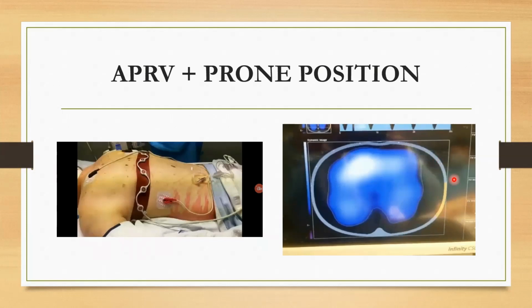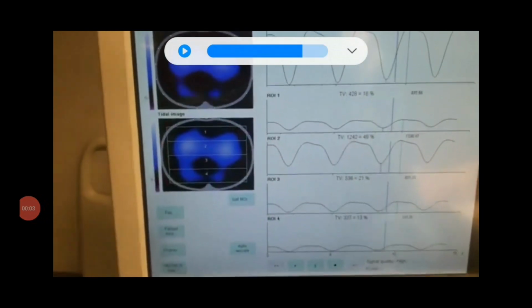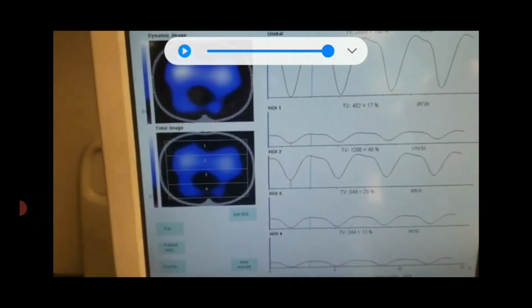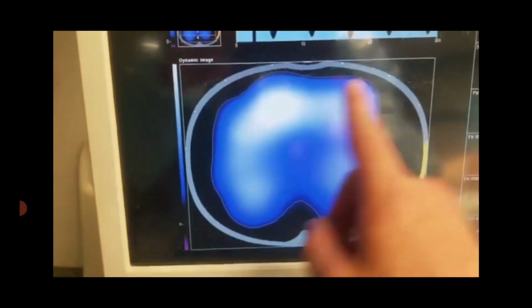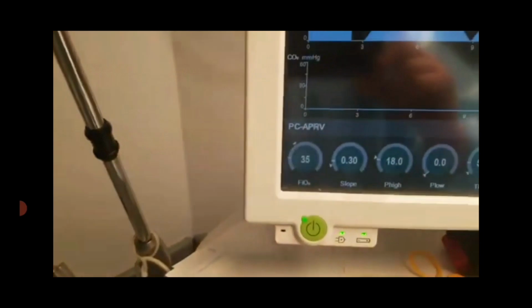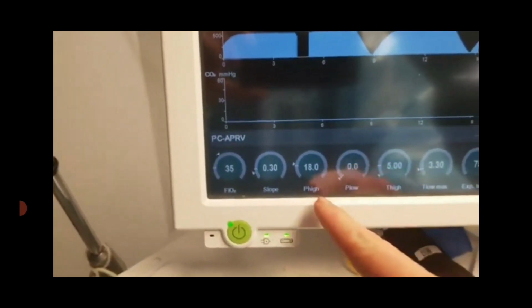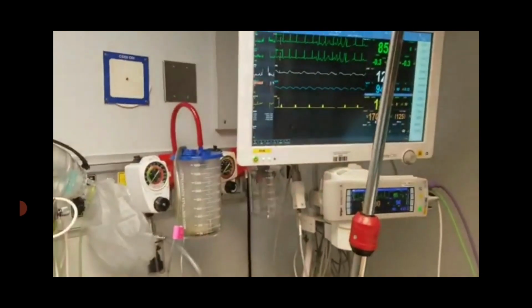So I sent a 24-second video to the doctor. I'm quite happy and giddy because of the amazing result, and you'll probably hear that in the tone of this video. When we were in the recovery room having trouble with the dorsal region, and watch this. Boom! I love my job. He's down to 35%. We got a P high of 18. And he's sating 94.